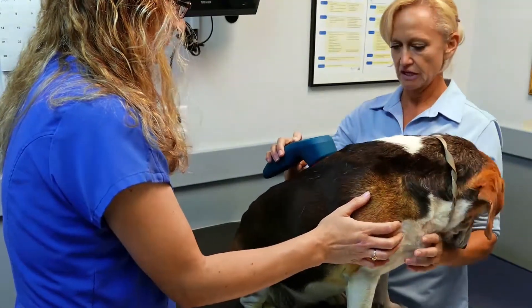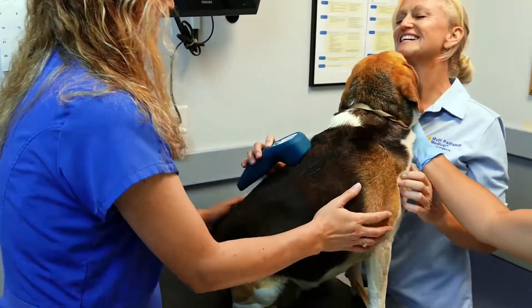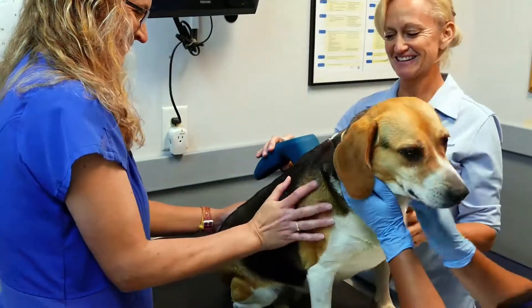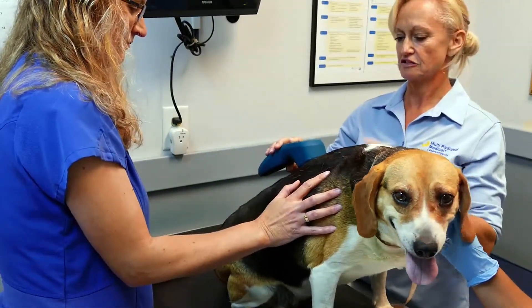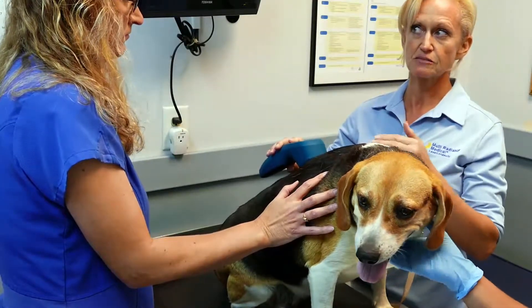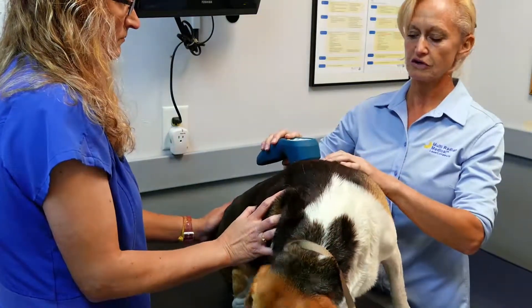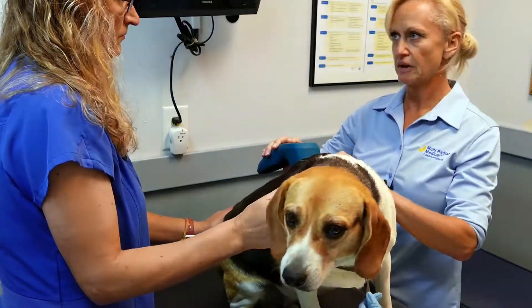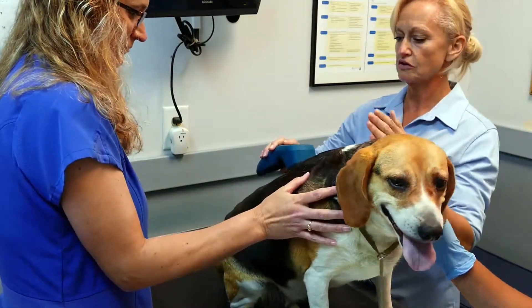Whatever you're looking at, it doesn't matter if it's a dog, cat, horse, or ferret. When you look at something, you're going to think: okay, there are two sides to the laser. You're either stimulating something — to stimulate repairing, healing, creating new cells — or you're inhibiting something, which is shutting down pain, shutting down inflammation, shutting down neuropathy. So you're going to go one way or the other.